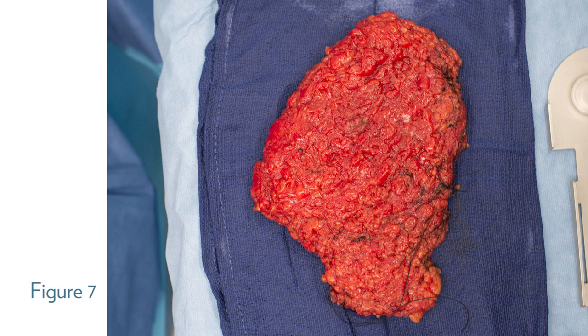This is the final specimen. I mark it and send it to pathology. I always mark the nipple margin so that they can be sure that that margin is negative. I mark the lateral margin and the superior margin for orientation. Our pathologist will take a separate section at the nipple to ensure a true negative margin along the base of the nipple. If you have any question about whether or not you got a true margin along the nipple, you can evert the nipple and take a separate margin at the time of dissection and send it for frozen section if there's any concern about the tumor being close at that level.